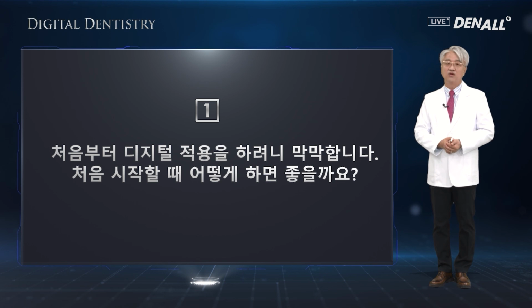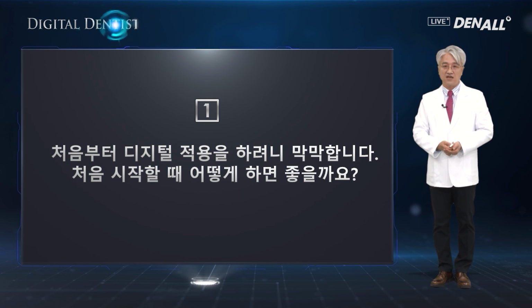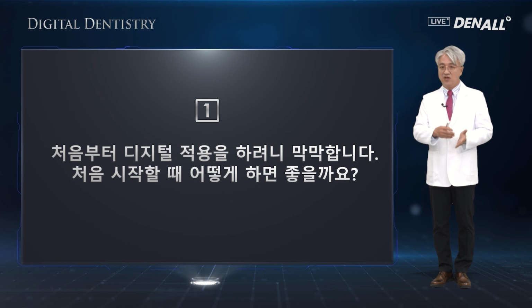And then the next step could be using zirconia crowns with digital dentistry. So don't rush into things. Gradually, step by step. If you set up digital dentistry in your clinic like that, then without much stress or problems, you will see your clinic transforming to digital dentistry.